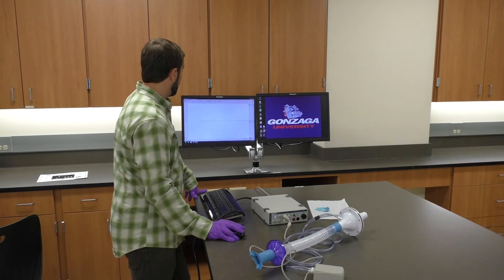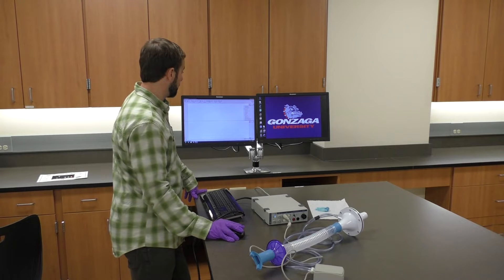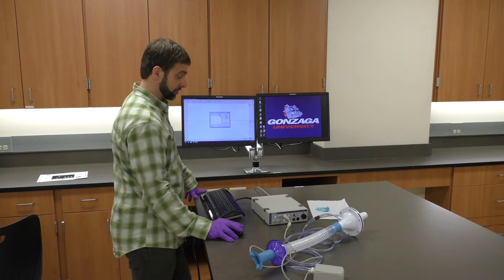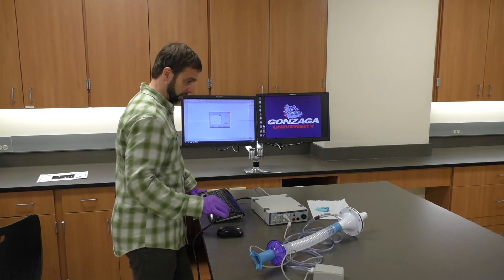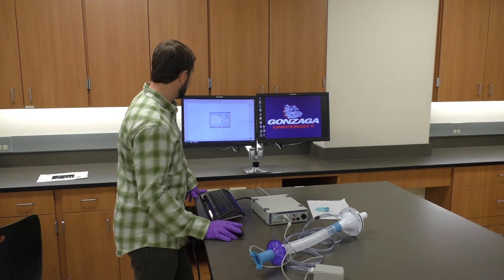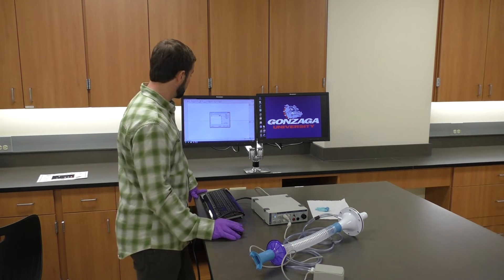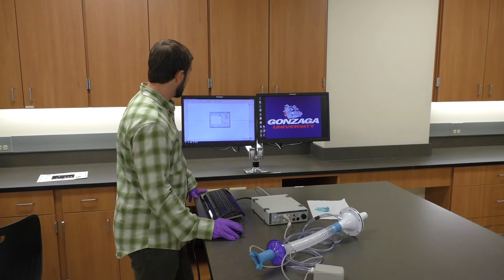At this point I will zero my flow head. I'm going to go into the flow head channel pop-up menu, click 'spirometry pod,' and then zero that. I want to make sure none of my lab partners are touching it at the time — it should just be sitting on the table. As long as it's not moving, we've zeroed it and can click OK.